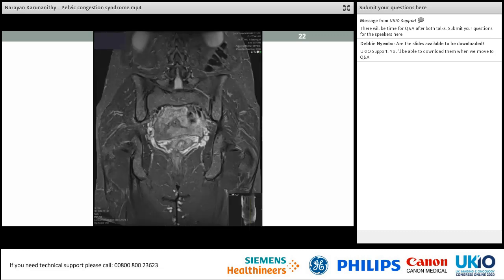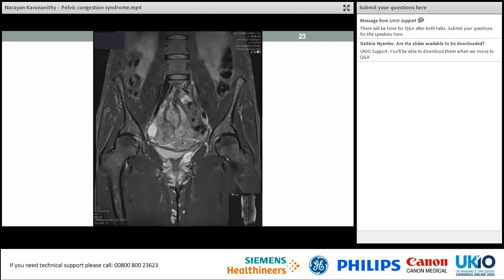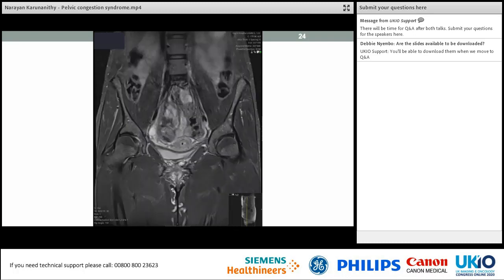And this is the MRI scan on that patient, which shows that what you see quite commonly is the dilated parametrial veins, and this shows these dilated veins extending surrounding the vagina. And as you can follow them down, you can see that they communicate with the paralabial varices that this patient clearly had, bilaterally on the right and the left. And as we go down even further, you can see that these then communicate with these high medial thigh varicose veins.